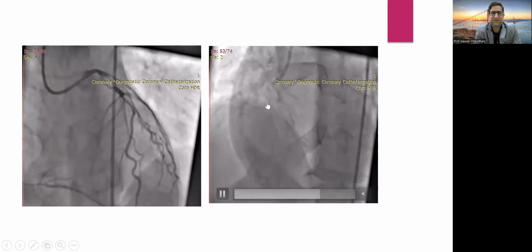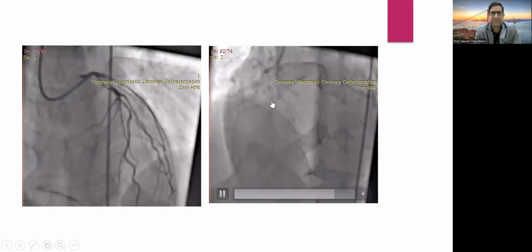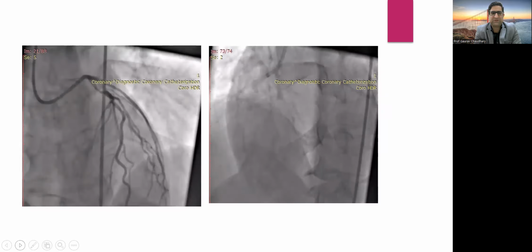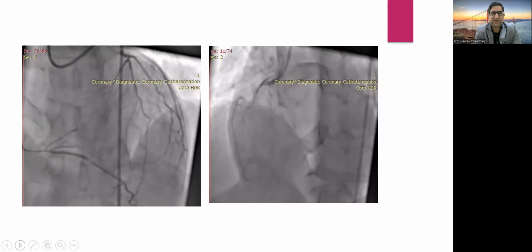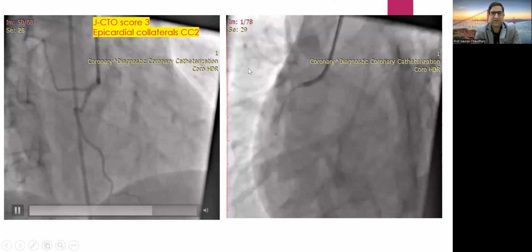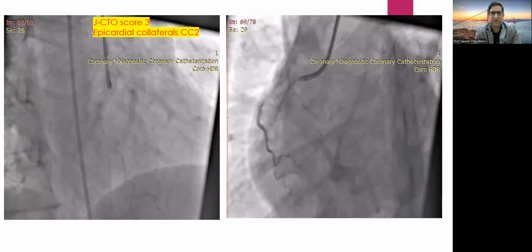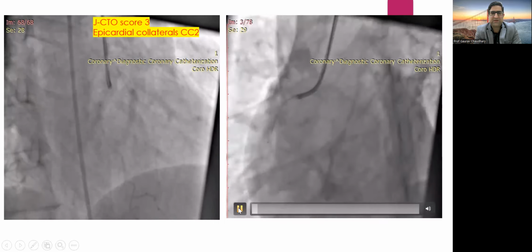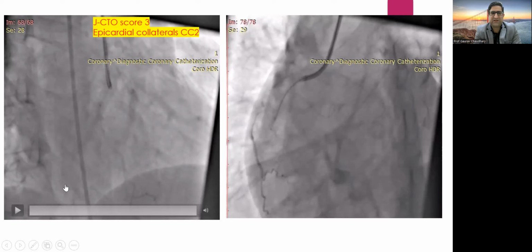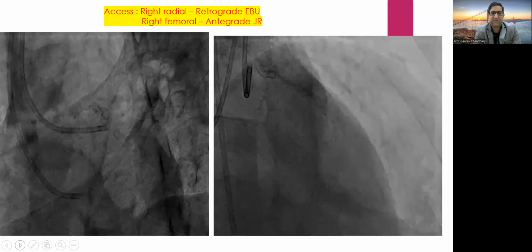In this case we can see there is an RCA total occlusion in the middle segment, but of course there is a large branch coming at the point of entry, and it is a very long segment. This was tried to be negotiated over the microcatheter. Various wires were tried, but being a long lesion, even the XTR was not going into the channel. Having a longer segment and a branch at the site, it was more difficult, and it was unsuccessful in the first attempt.